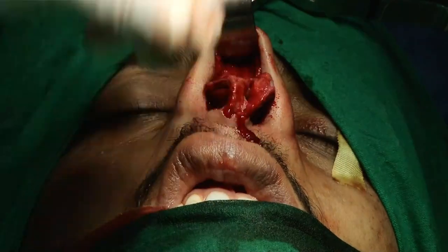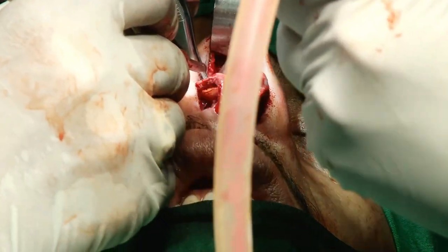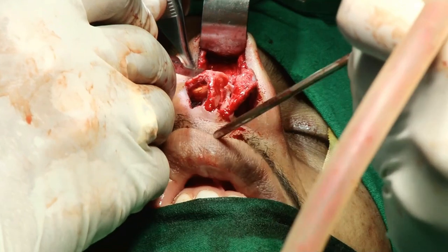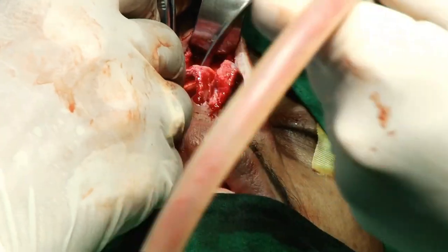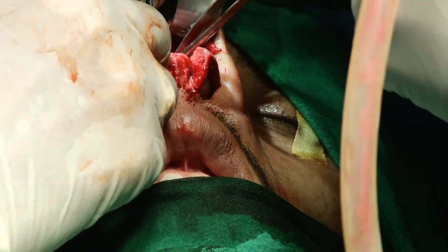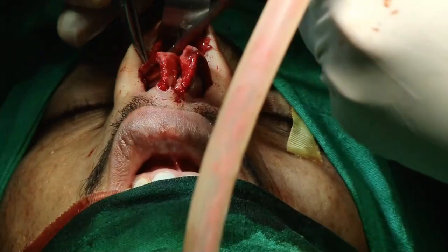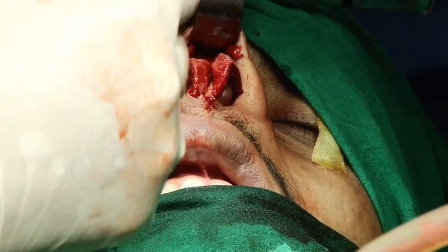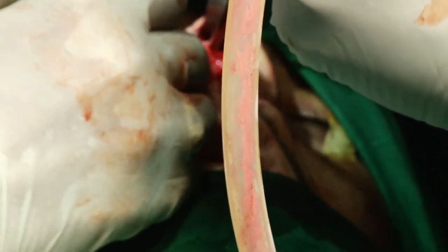So just we lift up this. We make a cartilage only. So just we make an incision on this only bone to find the subperiosteal plane. Because on to the rest, then you just go to the subperichondrial plane. So give me the cottle over there. Yes. So now look there. This is my subperiosteal plane.